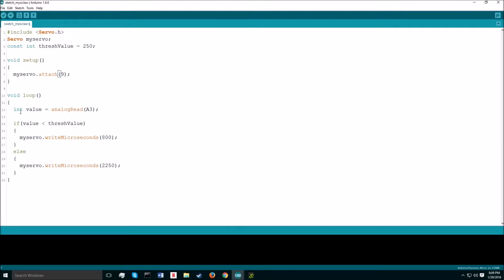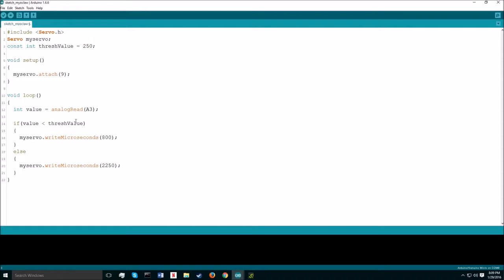In the loop, I create an integer called value, which is equal to the analog read of pin A3 on the Arduino board. Pin A3 is the same pin that Myoware is attached to. So, in this if statement, it says, if the value of the Myoware is less than this thresh value that we created up here, then it will tell the servo to move to a certain position.